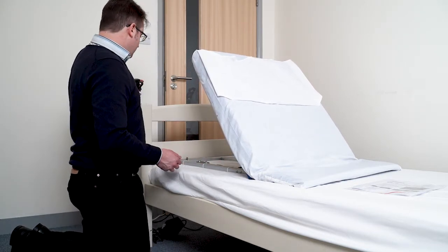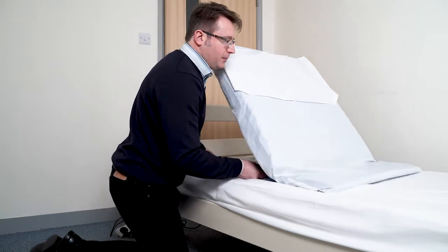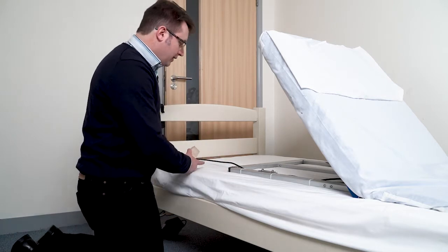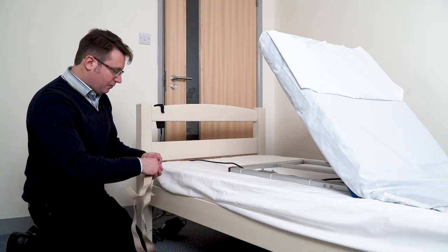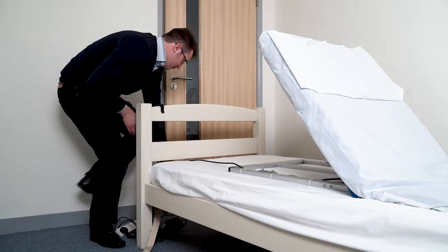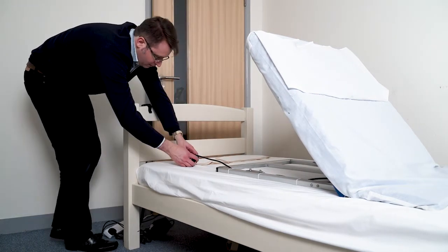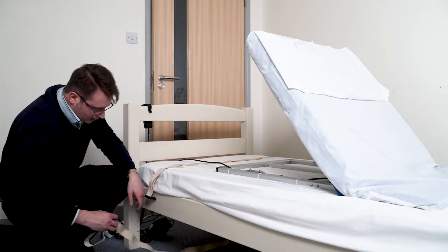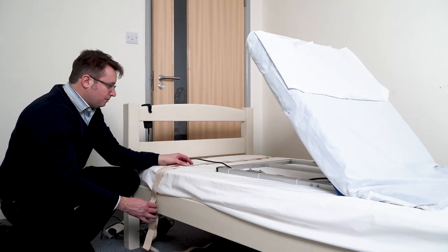There we go. So if I elevate the backrest, what I'm going to do first of all is to slide the PillowLifter down the bed. And I'll take the strap. Now it can either be strapped just around the mattress, or it can be strapped around the mattress and the bed base as well. Perhaps just for clarity, I'll strap it around both aspects. So it's easier for me to split the 2 halves. I'll take it around the bed and back down to this side. And what I want to do is connect the 2 halves of the strap together, but I want to keep it quite loose at the moment.